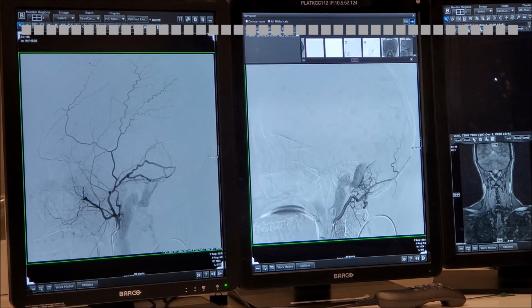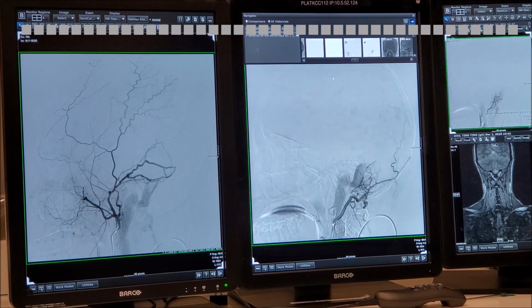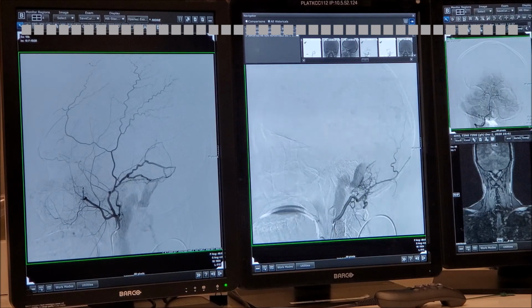I'm going to use this for a moment. This is the same one, you went back to it. You just need to do it a little bit lower. And here is the vertebra. I'll put it there for you, just want to see what I'm seeing. Here the patient is tired and moving and so on. So we're missing something here.